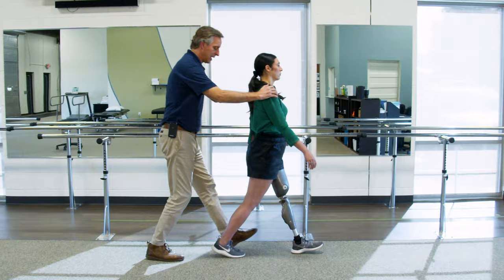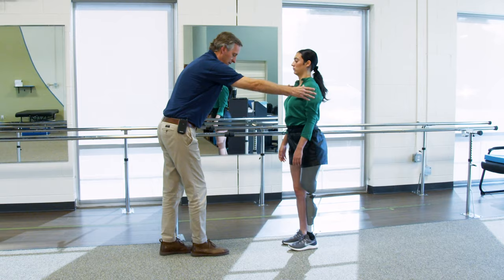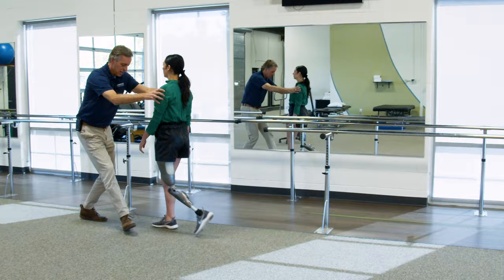Hold right there. Turn around and come back. Same issue. I can be in front of her. Go ahead and walk right at me. Boom. There you go. Good. Just get out of her way and bring those hips into the equation.